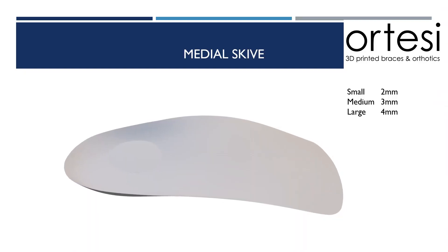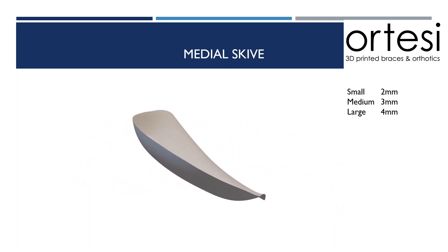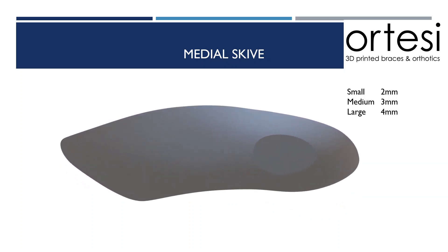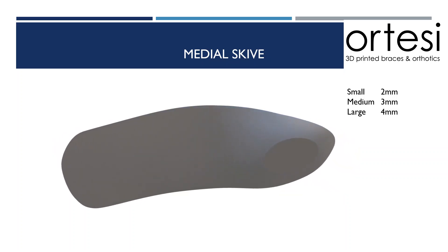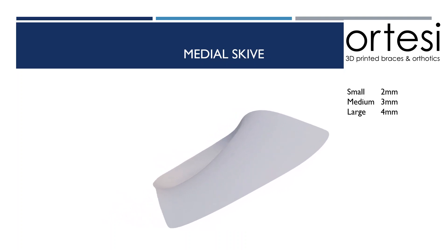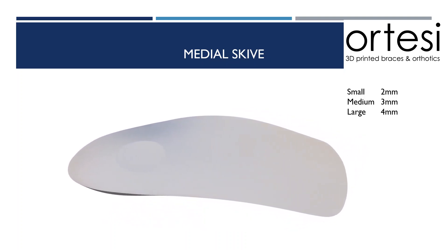Our first common modification is a medial heel scyve. A medial heel scyve increases the pressure on the medial side of the subtalar joint axis to increase the supination moment around that subtalar joint axis, so it's useful in a traditional orthotic design where you would also like some rear foot correction. A small medial scyve is 2mm, medium is 3mm, and large is 4mm.